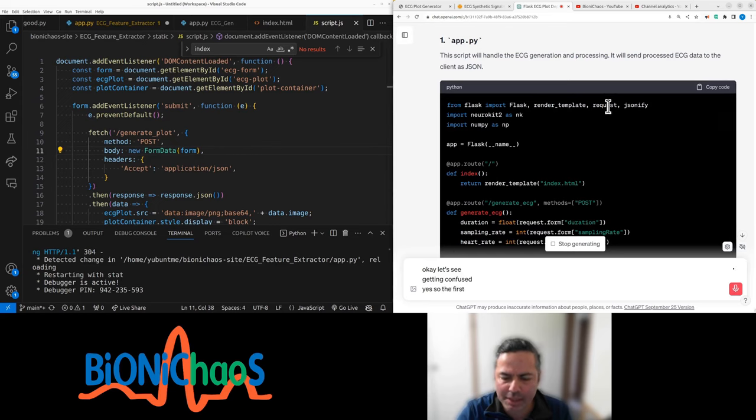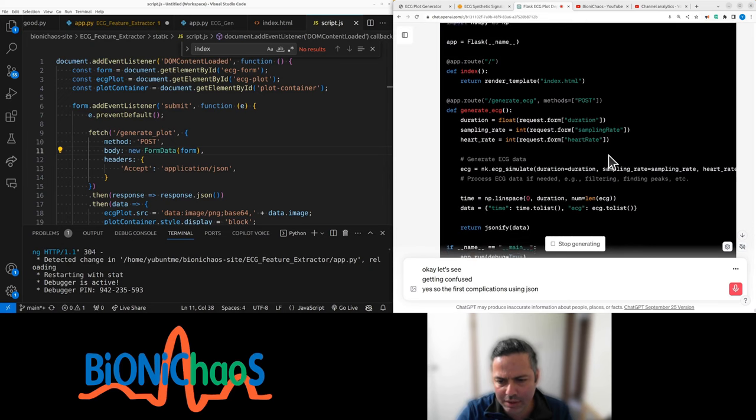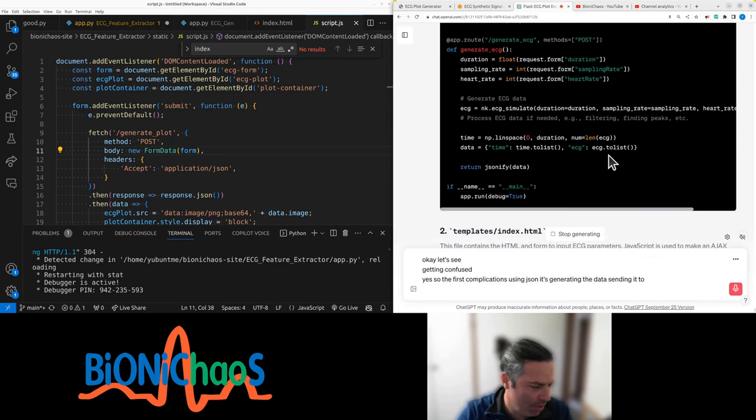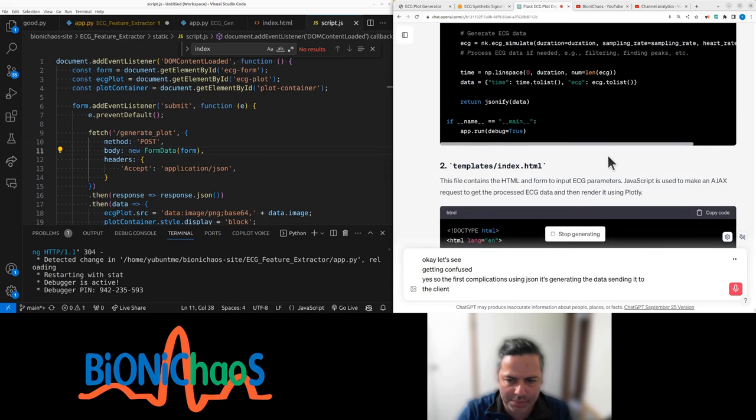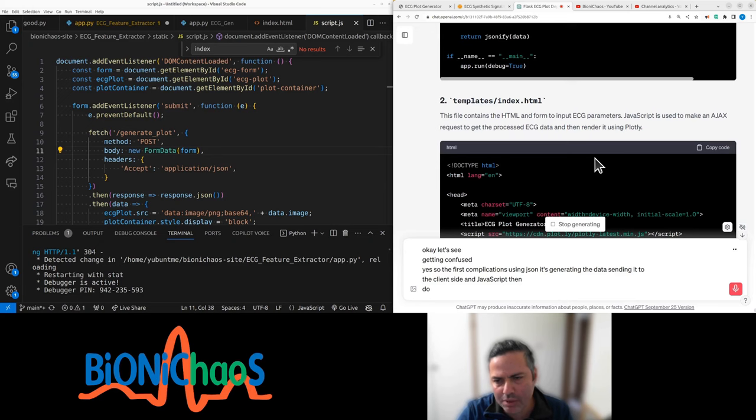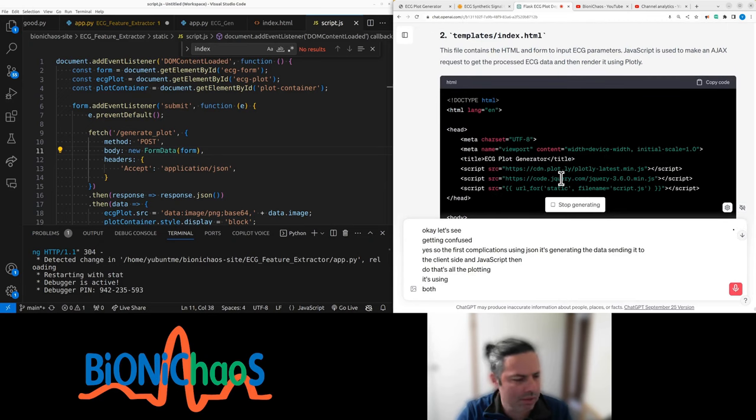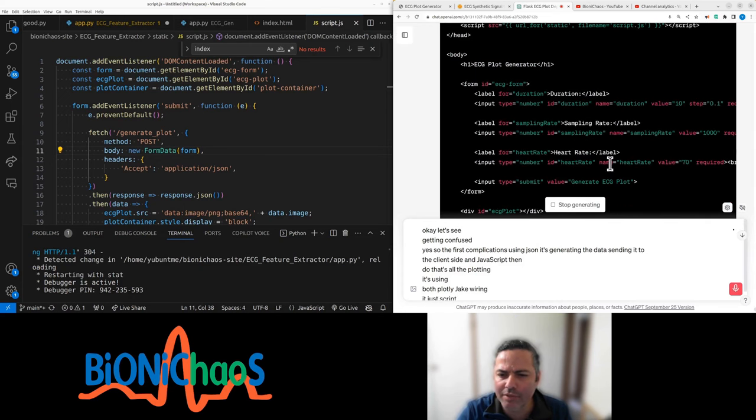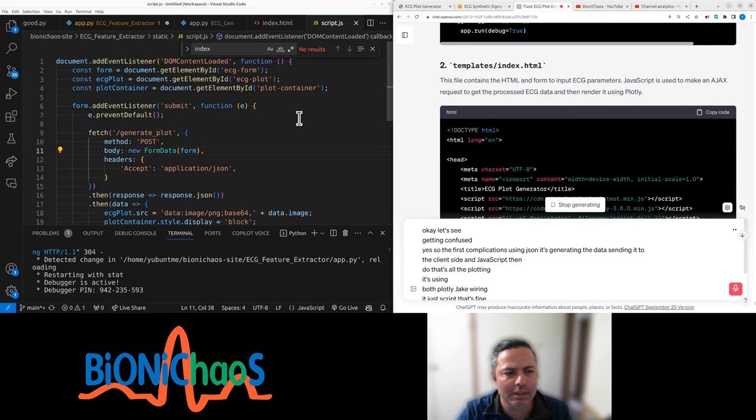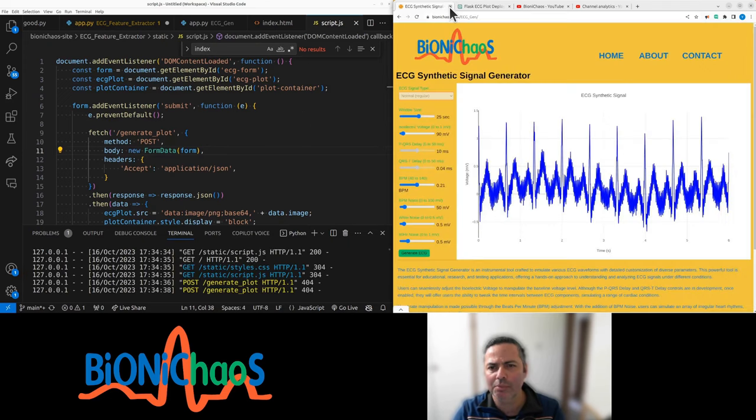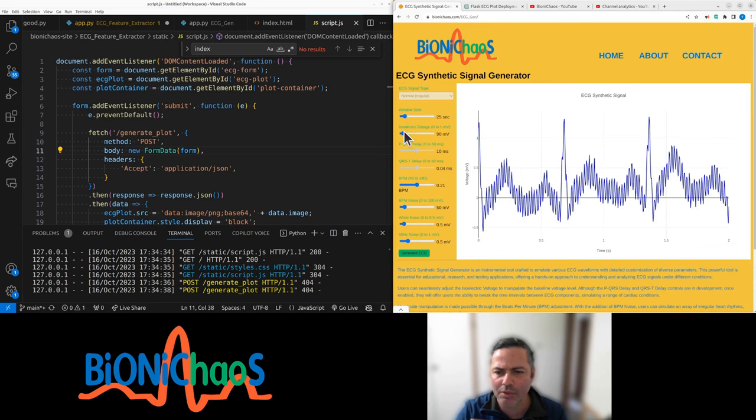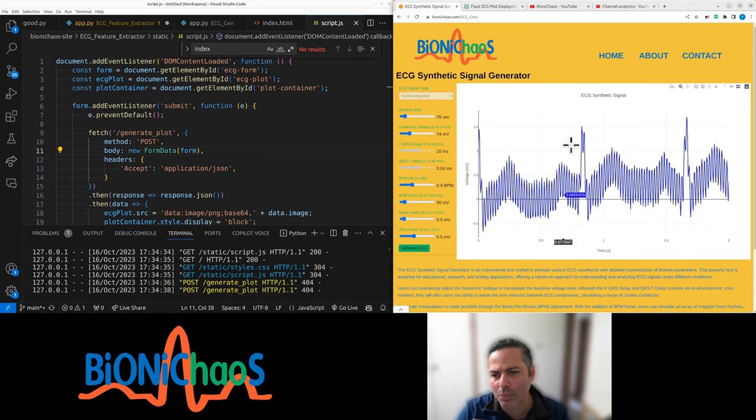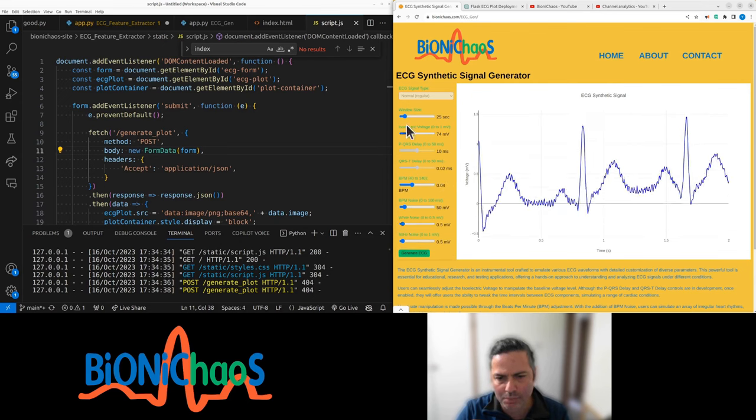So the Flask application, the Python script is using JSON. It's generating the data, sending it to the client side, and JavaScript then does all the plotting. It's using both Plotly and jQuery. That's fine. Let's update this. Might as well get rid of it. Eventually it will be similar to this application, except that we'll have the different components of the ECG waveform labeled.